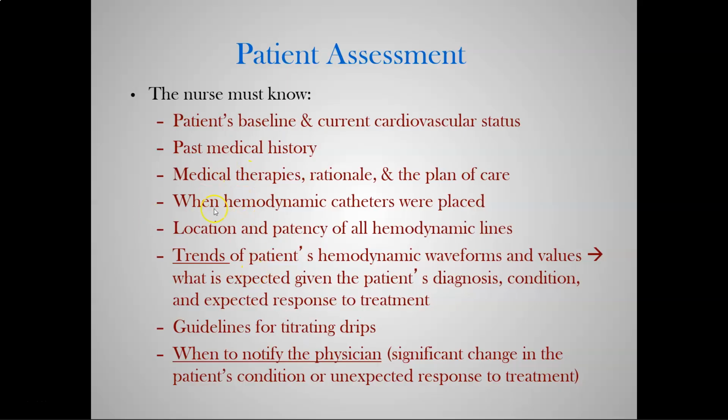I could go over patient assessment, but honestly, it's stuff you guys already know. Always have a baseline. And remember, we're not using these devices to establish baselines every time. We establish the baseline when we insert these things. I establish the CVP base. I establish my arterial line base, my Swan-Ganz and wedge pressure bases, pulmonary artery pressure bases. We then trend from that point on.